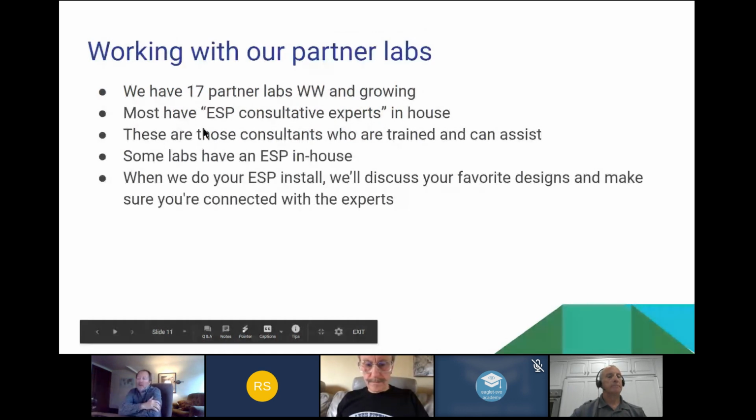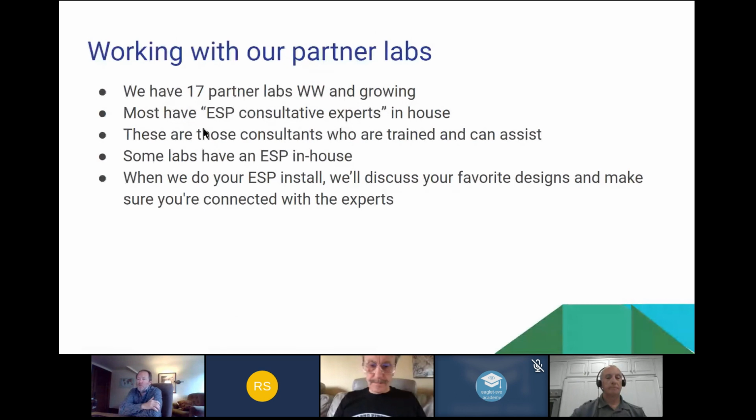So, work with our lab partners. We have over 17 lab partners worldwide. I've already mentioned that. Most have an ESP consultative expert in-house. In other words, somebody who's been well-trained on working with us, and with you guys, when you show imagery from your ESP and understanding the MSR files that you might transmit. They give them all the detail they want. Often you're going to be able to tell exactly what.